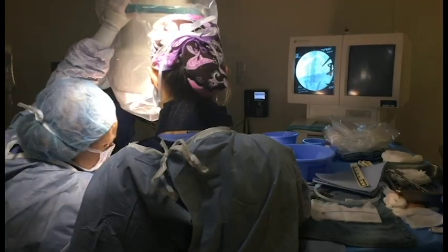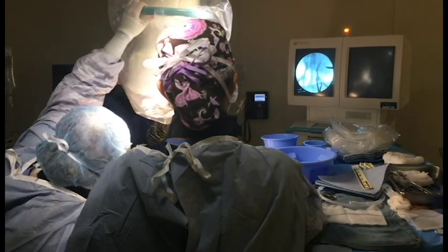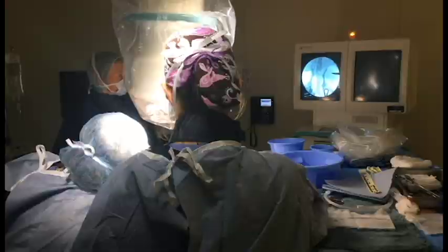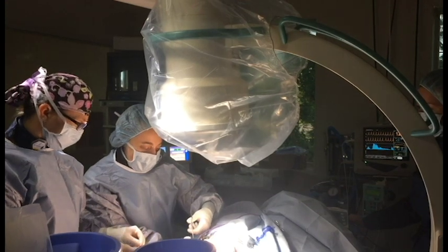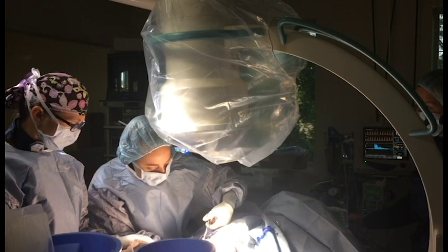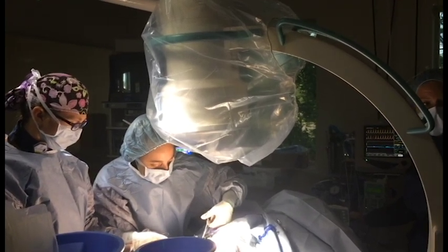So what this does is it makes it so that we can actually relieve the obstruction in the kidney without having to do surgery on the ureter, or microsurgery basically on the ureter, and prevent those strictures from happening. We don't have to open the ureter at all. So it's a lot more effective, and it's a lot easier, quite frankly. Easier is helpful, especially when you're working on tissue that's super tiny, like Dr. Hammer said. It's really hard to do a ureteral surgery.